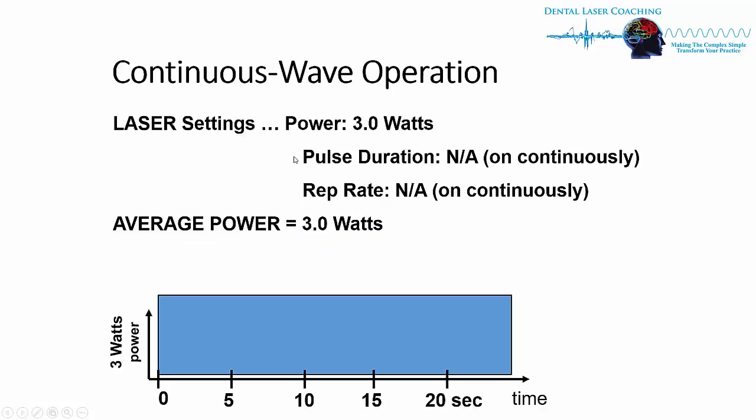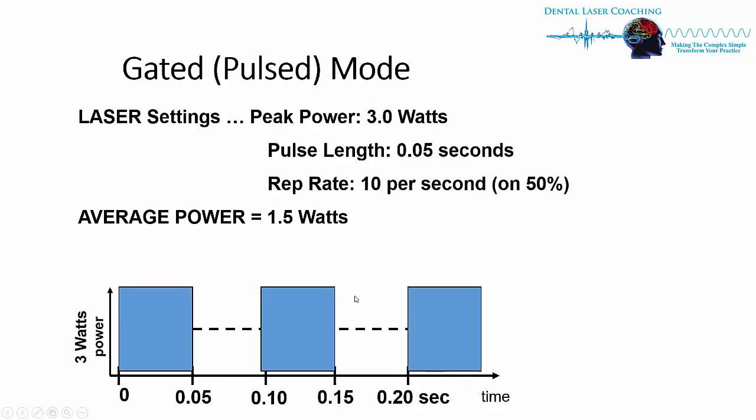We can have the laser coming out in a continuous wave. In other words, the laser is on and it stays on the whole time. Okay, it's not on or off. So this is 3 watts of power over 20 seconds of time.